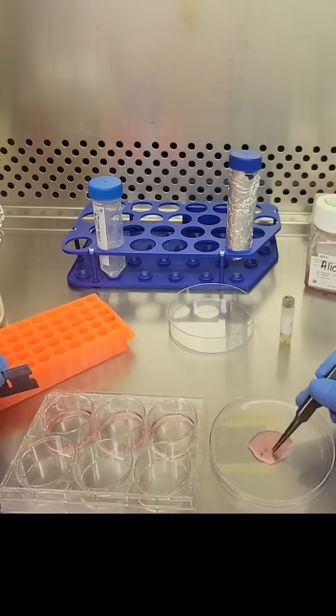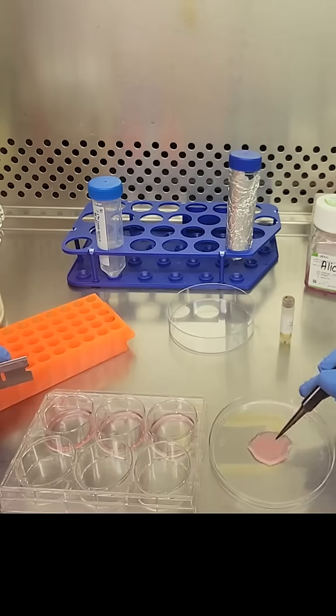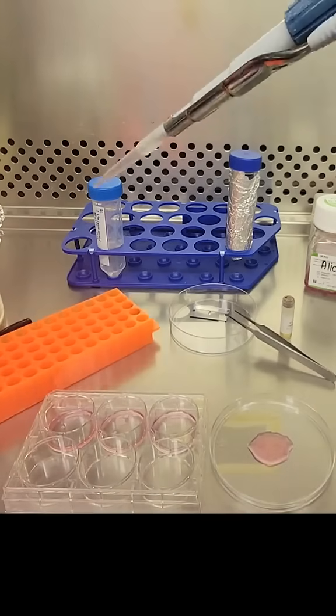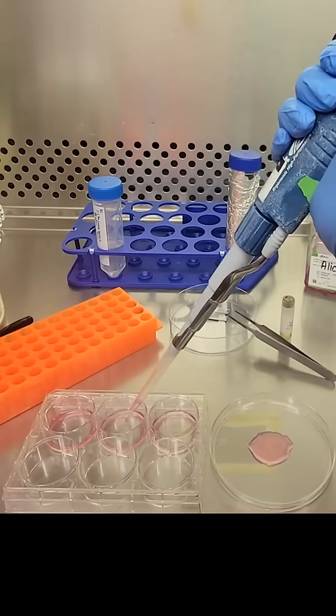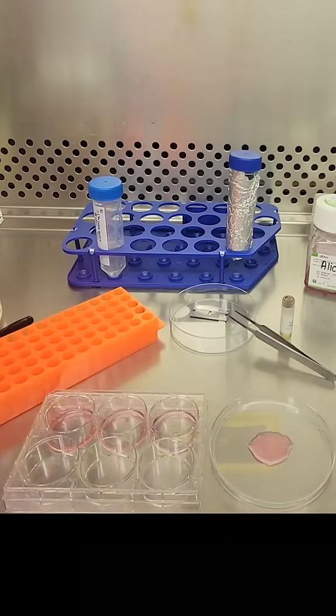Each well got about two to three pieces of skin biopsy with just enough media so that they're not floating away. This whole process of isolating cells from these samples will take about a month to two months. So every couple of days I will check these cells and check back in with you guys to see how they are growing.